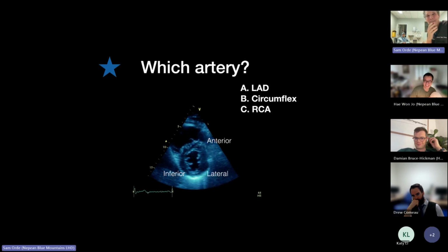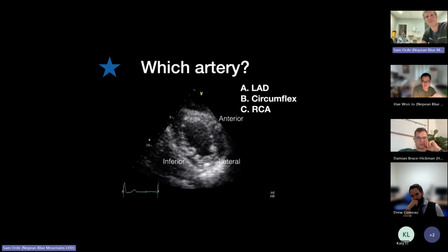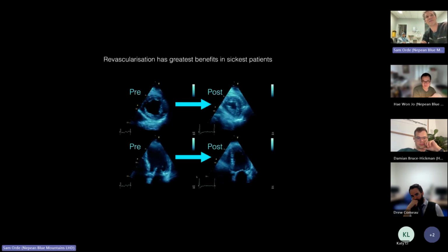Yeah, sure. What I can show you is that it looks like the anterior or the septal area looks like it's thickening. Anterior and inferior looks like it's thickening. And it's just the lateral that looks thinned and bright. So that would be in keeping with someone who's got circumflex chronic ischemia for me. Okay. And that's about the same. Right coronary can also be affecting the right heart.